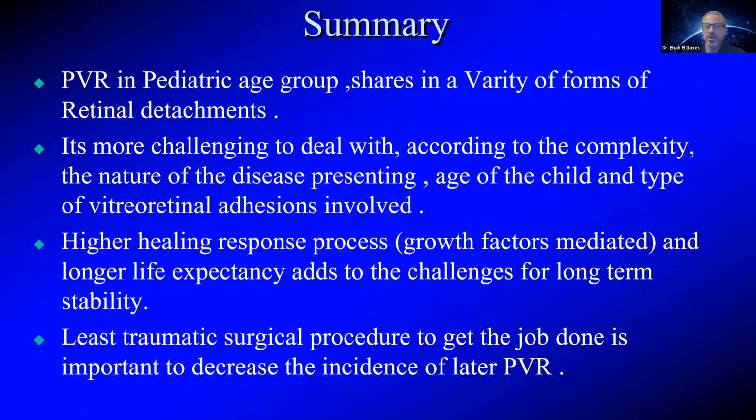We have to keep that in mind in the original surgery, deciding what to do. The least traumatic surgical procedure to get the job done is very important to decrease the later post-operative PVR that we see with pediatric age group. So this was my talk, and let's open up a discussion then.